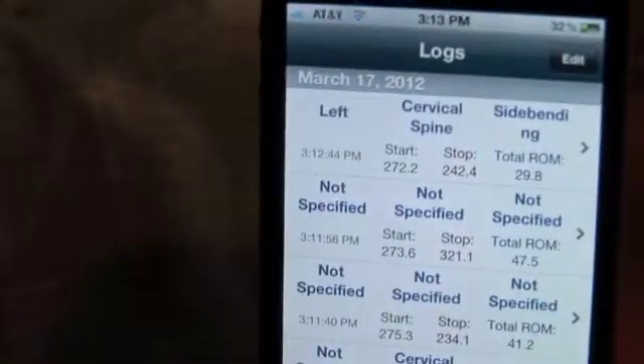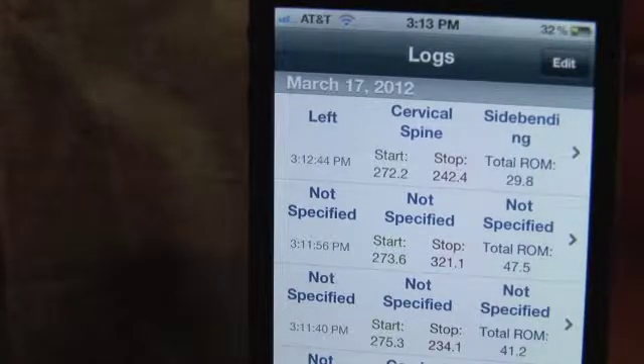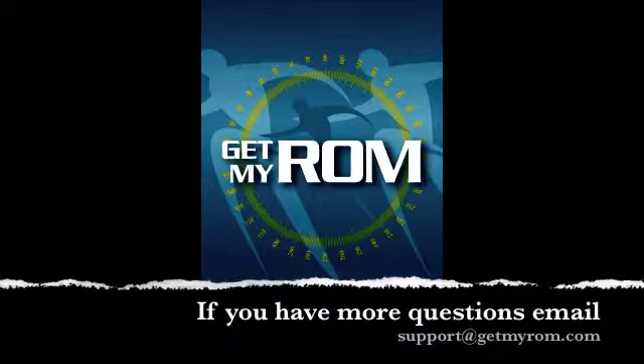When you are finished, press done. It is now saved in your log. Please contact us if you have any questions at support@GetMyROM.com.